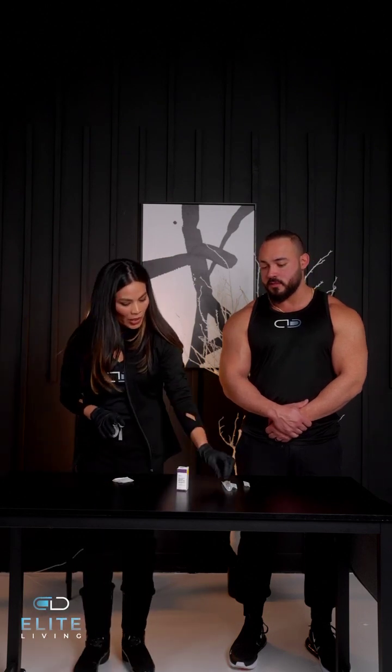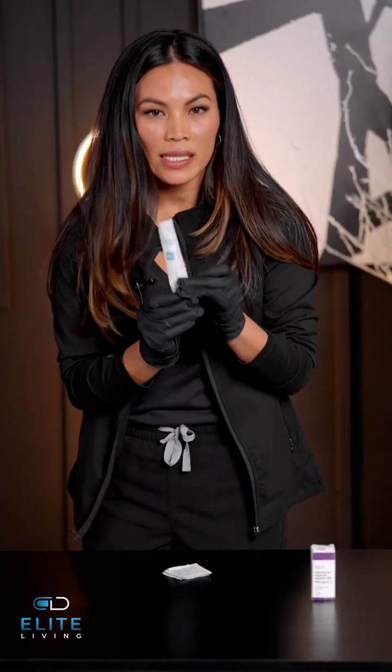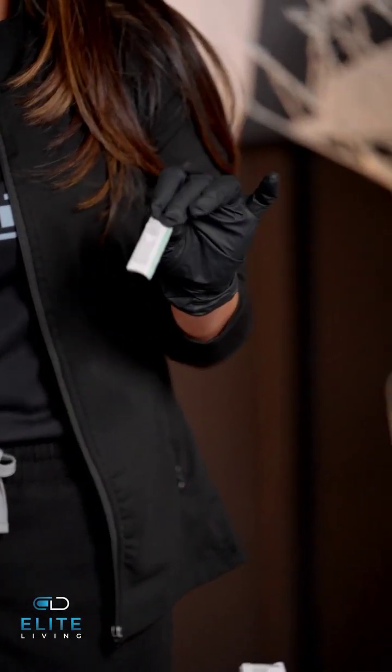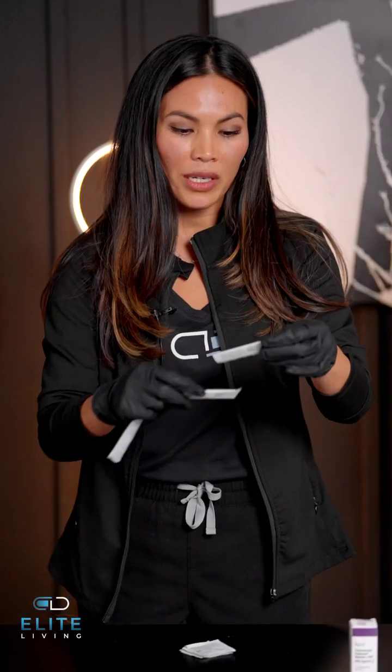Here we have the medication, which is testosterone. You're going to receive a 1cc syringe and you will also have two needles. There's going to be two different sizes — one of which you're going to use to draw up the medication, the other one of which you're going to administer the medication with. So you take the bigger needle to draw up the medication, remove that, and then you're going to use the smaller needle to inject.